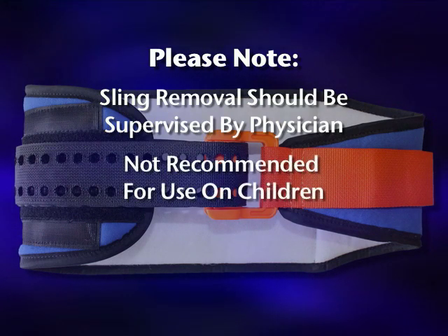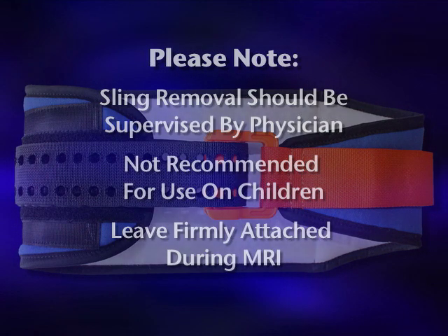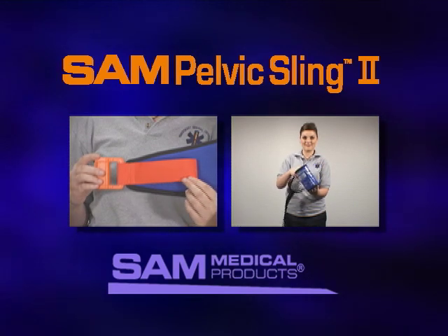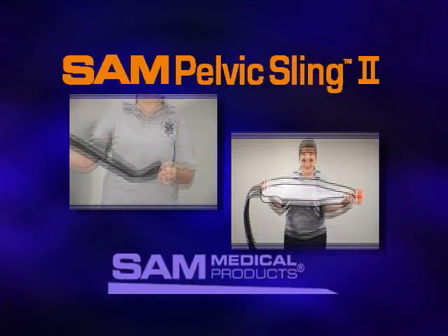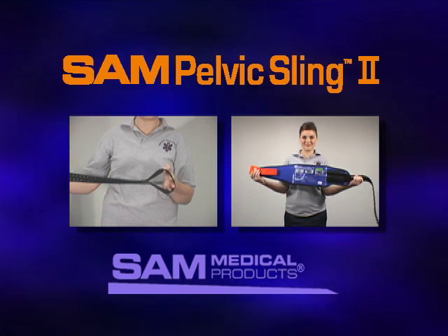This product is not recommended for use on children. The SAM Pelvic Sling 2 should remain firmly attached to the patient while in the MRI room. The SAM Pelvic Sling 2 — the first and only force-controlled circumferential pelvic belt designed to provide safe and effective reduction and stabilization of pelvic fractures — is available in both civilian and military colors.